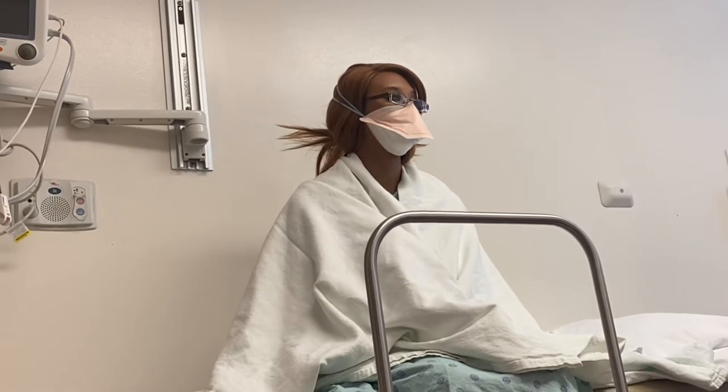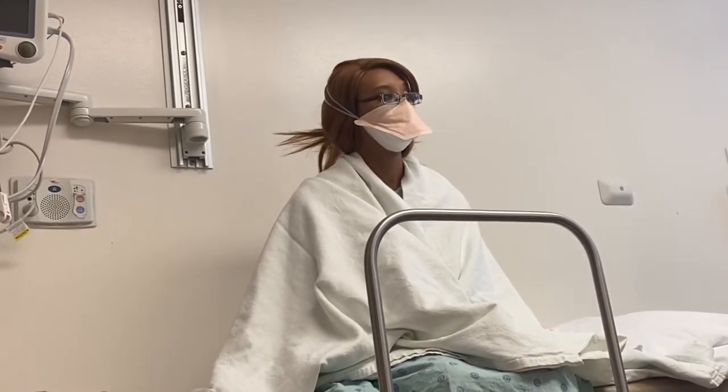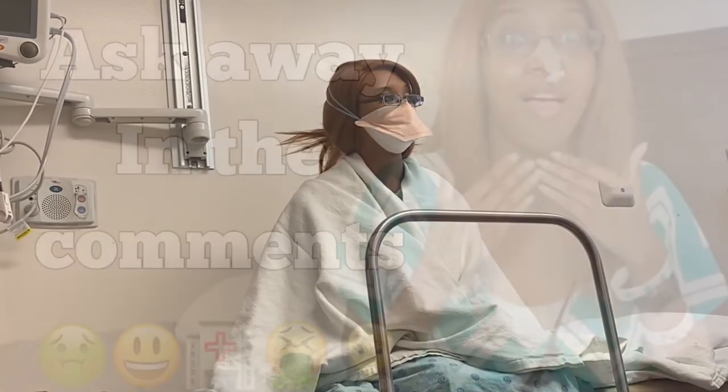Is there a particular nostril it has to go in? Whatever you say, it doesn't matter either. Because some people have had surgery on their nose, and they know they have a history of a broken nose, and we know they can't get the tube on one side.